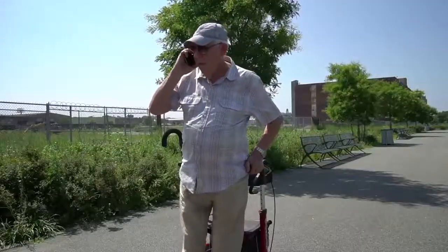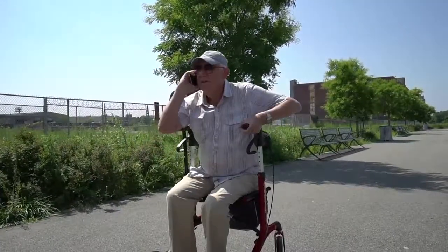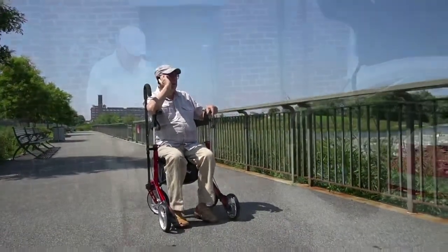The sturdy seat with back support will allow you to rest anywhere at any time, even if all the park benches are occupied. The durable, spacious, easy-to-clean storage bag is great for storing your phone, books, glasses, snacks, and many other items that may come in handy during your neighborhood walks.